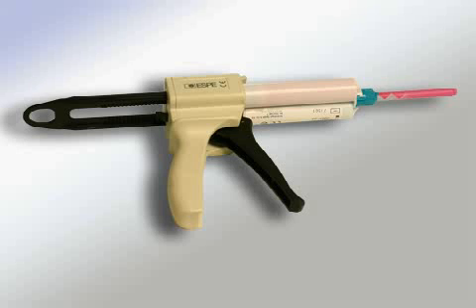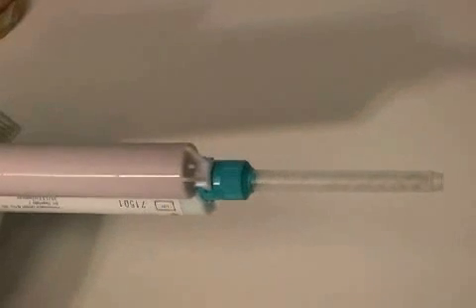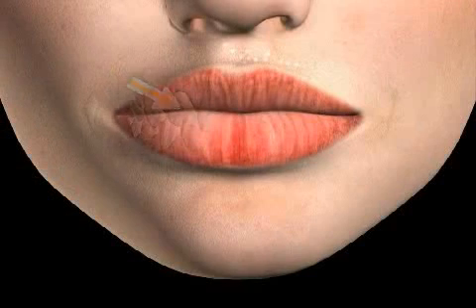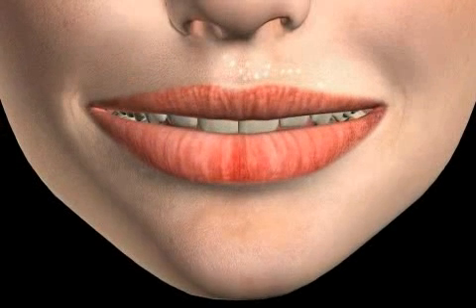Careful adherence to setting times and using pre-cast cartridges in which materials are mixed according to specified criteria, here you see such an application tip, will provide optimal and lasting results. For you, the patient, this means a tightly fitting dental prosthesis.